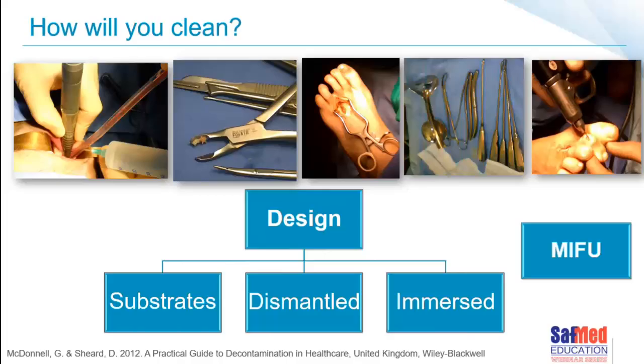Now, you may very well ask yourself, how am I going to clean a particular device? How will I actually clean it? I'm going to need to look at the design of the device, what it's made of, the various substrates, because that's very important. Is it something that I can dismantle or not? Is it something that has got blind corners to it?